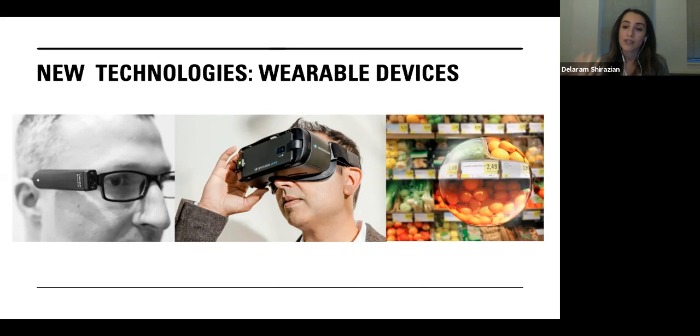So for example, if you want to read a newspaper, you can put your finger where you want the OrCam to start reading, and it'll actually start reading the text out loud to you. It does utilize similar functions as Seeing AI. You can program people's faces into it. It can recognize colors, barcodes, very similar things.